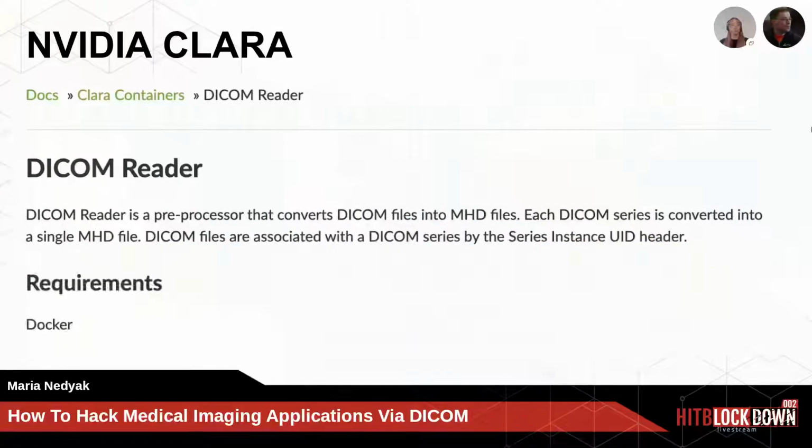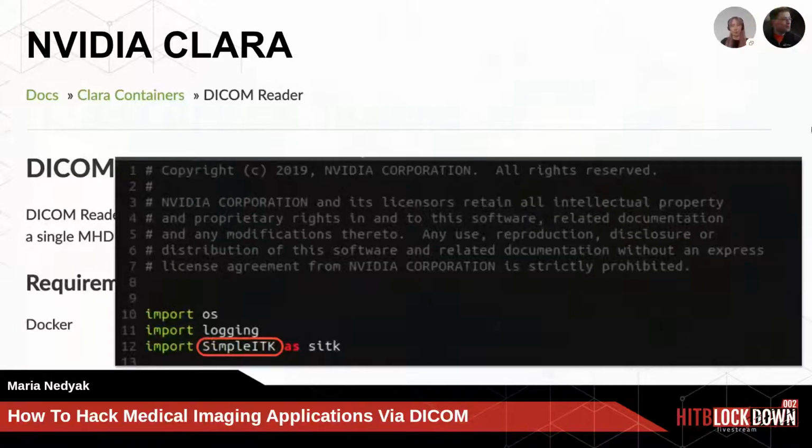The module which parses DICOM files in NVIDIA Clara is the DICOM Reader. DICOM Reader is a Docker container. You can download this container from the official site. And if you look inside, we can see Python source code, and as we see, it uses the SimpleITK library for DICOM reading.